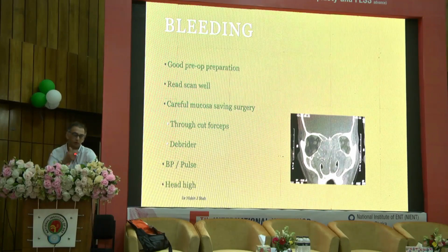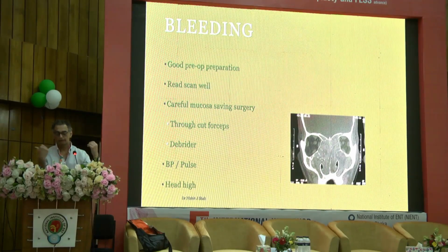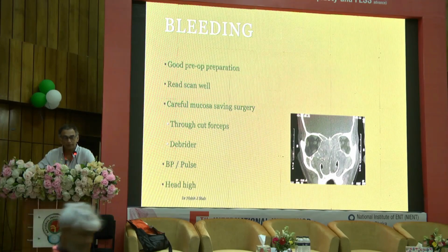So it's hand-eye coordination, right? Prof was mentioning earlier in his lecture that hand-eye coordination is important. It is very important because if your instruments are hitting turbinate, hitting septum, hitting mucosa, every time your scope goes in and out, it's going to get blood. You're going to get frustrated, and you're going to get more and more careless, reckless with your instruments. This also means that in the post-op period, more risk of synechiae.